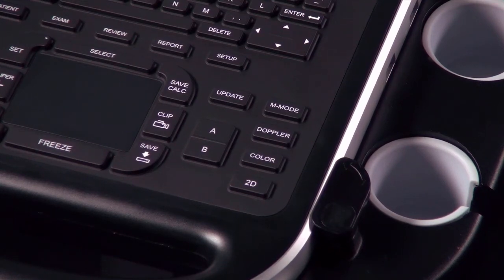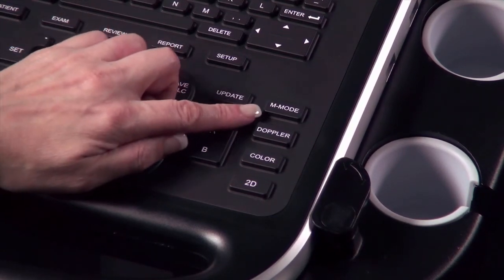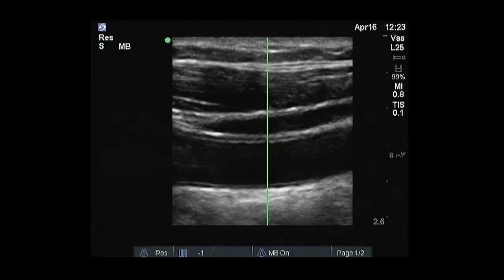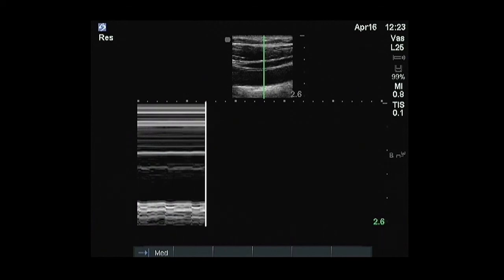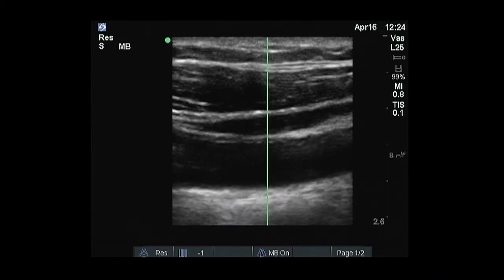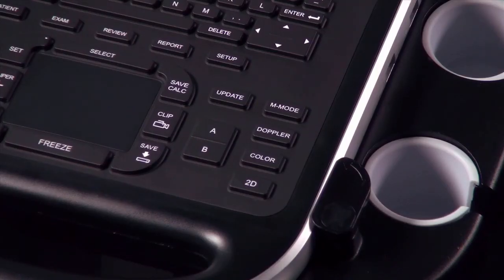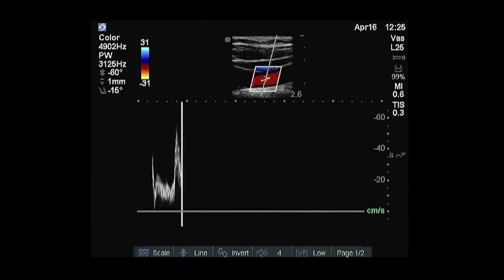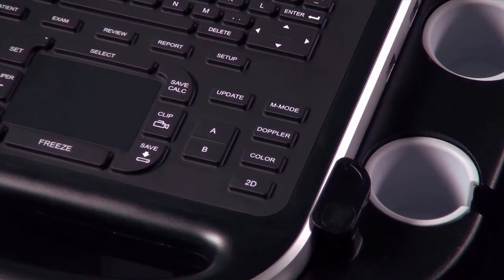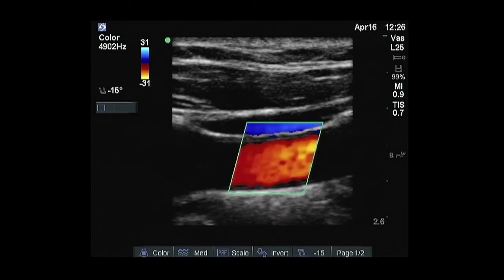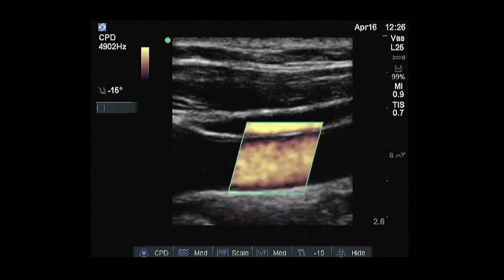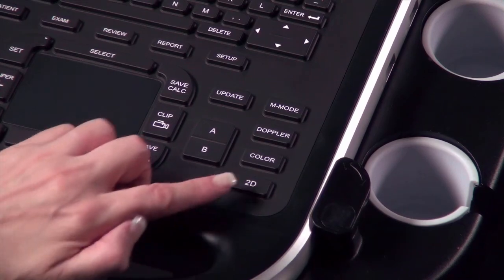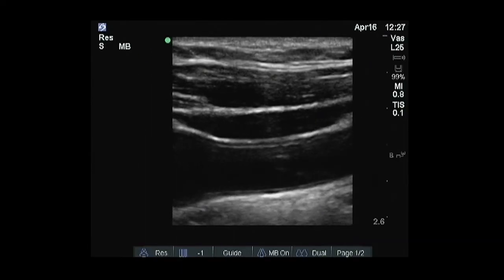The mode buttons are located on the lower right-hand side of the control panel. M mode turns M mode on and toggles between M mode sample line and M mode trace. Doppler turns Doppler on and toggles between Doppler sample line and Doppler trace. Color turns Color Doppler or Color Power Doppler on and off. You may use the 2D button to exit any scanning mode and return to 2D imaging.